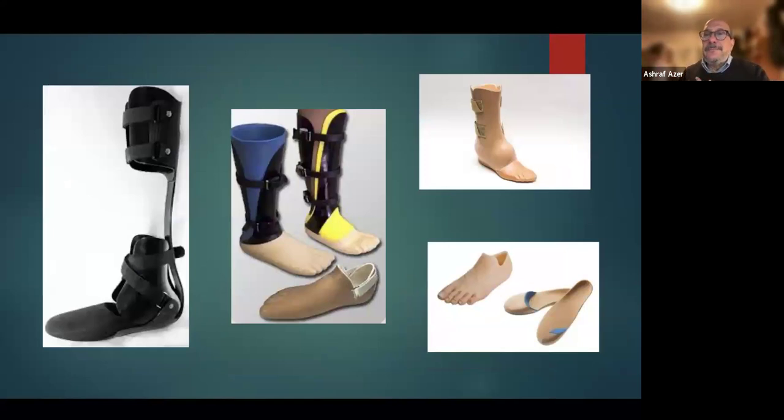You remember the Chopart? With Chopart, we cannot fit it with one of them, a foot plate with a toe filler. Why? Because it's an equinus, so you have to control the hind foot and put either an anterior or posterior AFO, like this one, to control the equinus created, and then fit him with an orthotic foot.